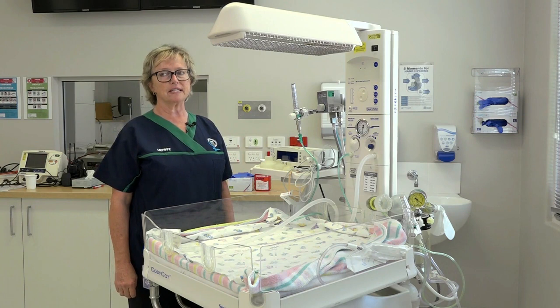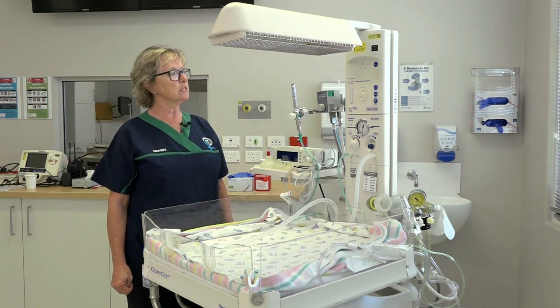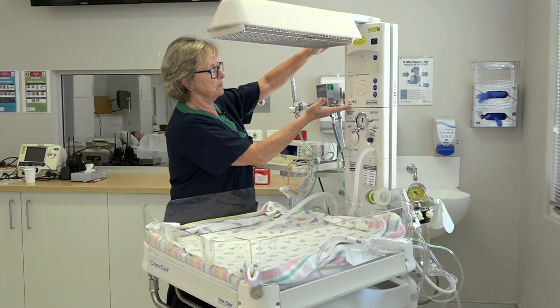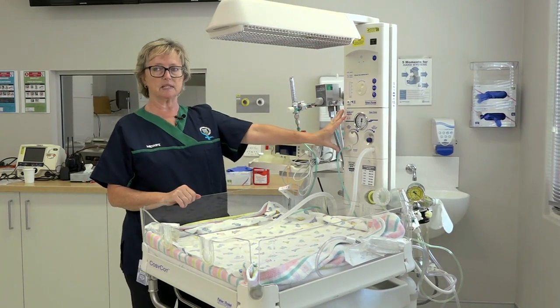There are a number of different resuscitation cots in Western Australia. One in common use is the Fisher & Paykel cosy cot, which we'll describe here. We've got the cosy cot component here, and this is our T-piece resuscitator.